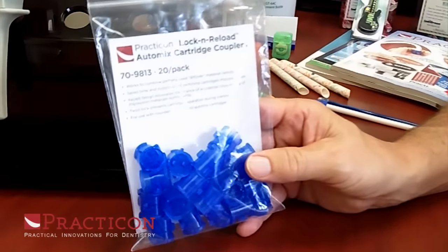Hi, and welcome to the Practicon Product Spotlight. Today we're going to take a look at a practical and innovative little product that's been great for us. It's called the Lock and Reload Auto Mix Cartridge Coupler. It's a great way to save you money and also cut down on waste in your practice.